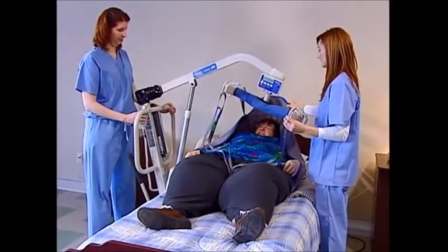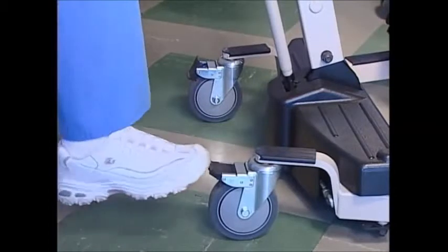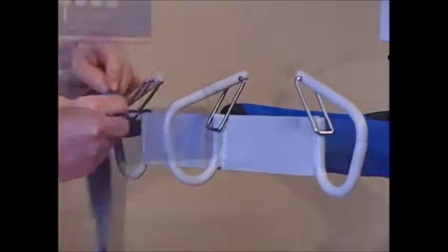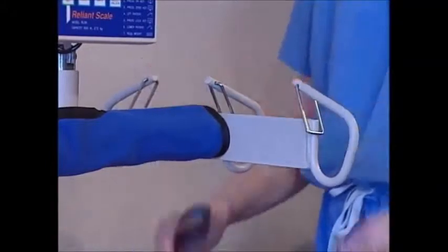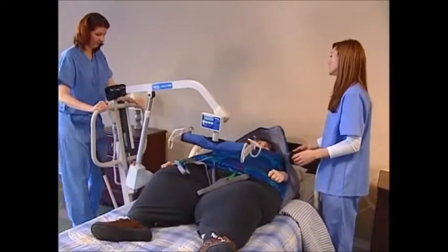Once the resident's full weight is on the bed, lock the lift's rear casters and unhook the sling from the swivel bar. Unlock the casters and move the lift away from the bed.